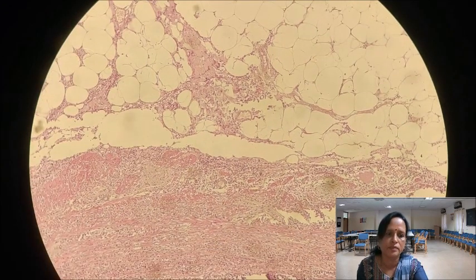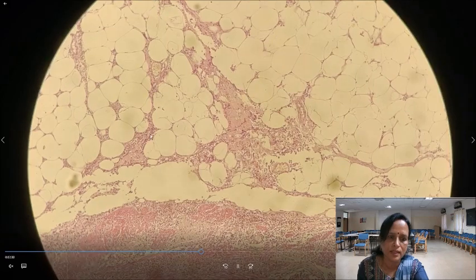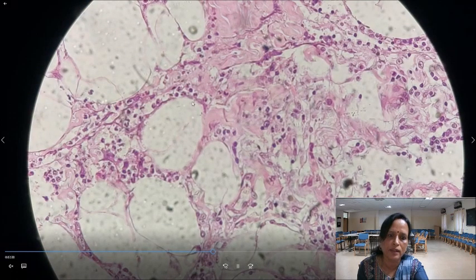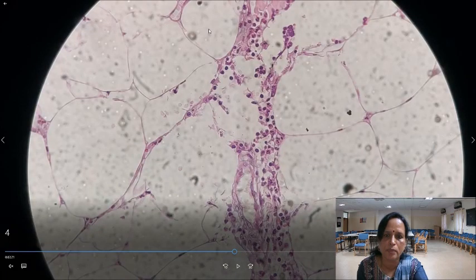See, dense inflammation. If you see this in high power, there are similar cells. See, they're all acute inflammatory cells. There are few chronic also. So here the inflammation has spread to the appendiceal, periappendiceal area also.